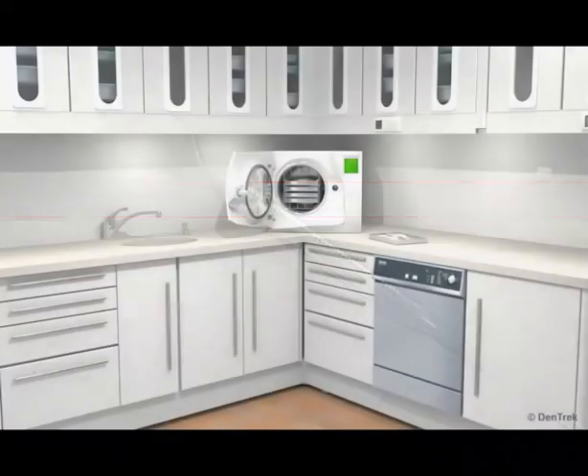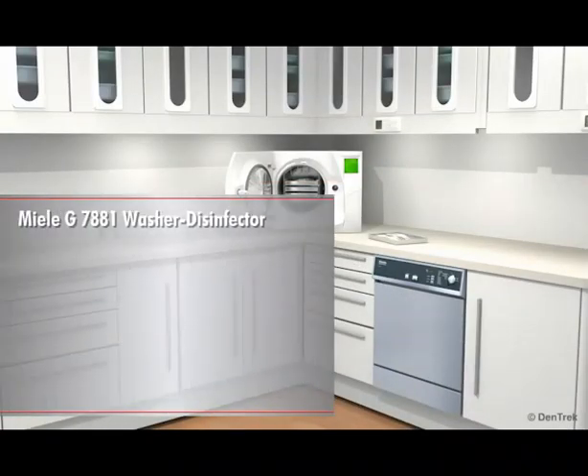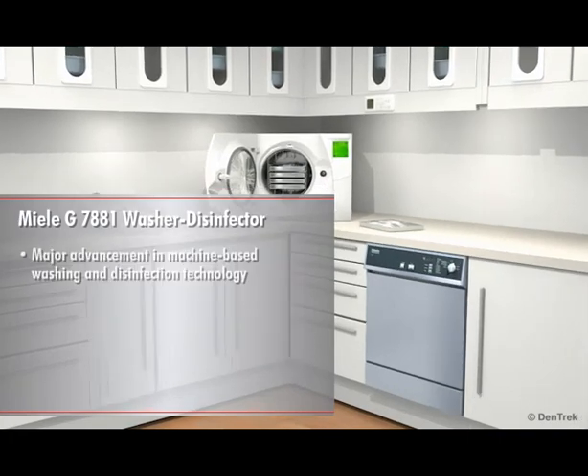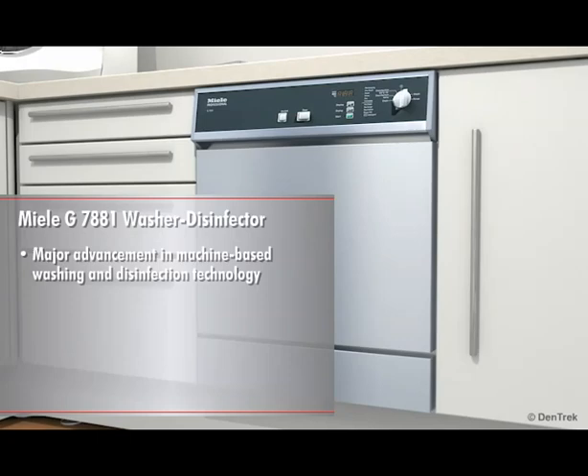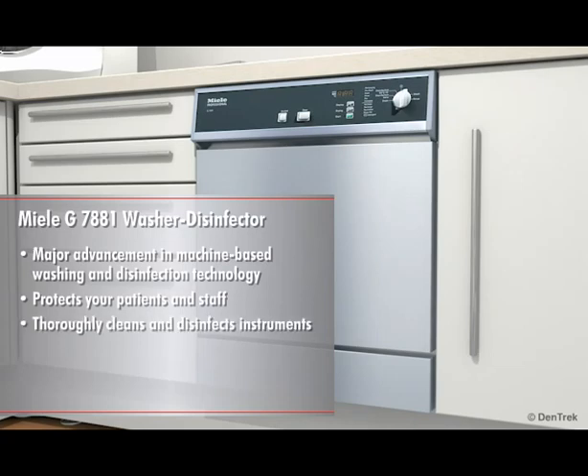This module will introduce you to the Miele G7881 Washer Disinfector, a major advancement in machine-based washing and disinfection technology. It will demonstrate how accepted instrument cleansing protocol is sometimes not enough to prevent cross-contamination, and it will show how the Miele G7881 protects your patients and staff by ensuring that every instrument that goes into your autoclave is thoroughly cleaned and disinfected.